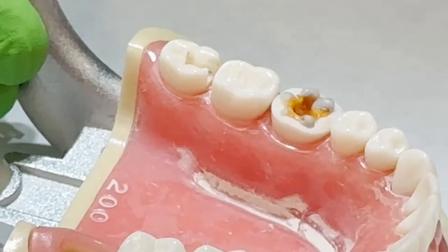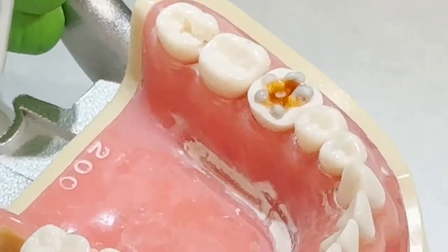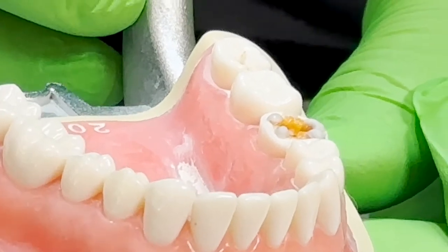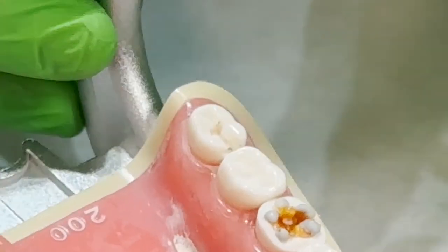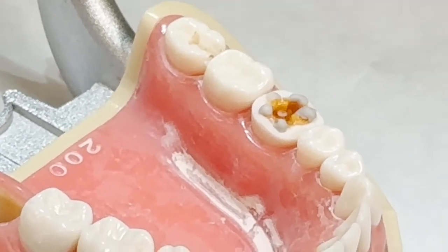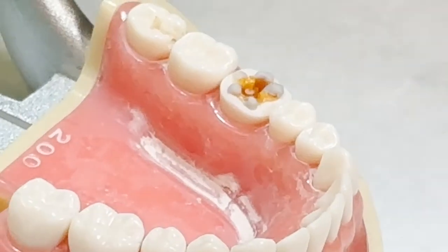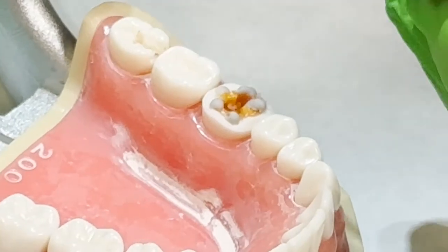Boy, it's awful quiet. So I kind of have, I don't know if you can see that, a basic start of where those cusps are going to be, okay? And then I'm going to build those up. Now, I don't have the opposing on right now, but you will need that as we build this up. We'll need to check the occlusion to make sure we're in the right place. But for right now, we're just going to try to build these up a little bit. And I can do that here real quick, I think. I'm gonna try.